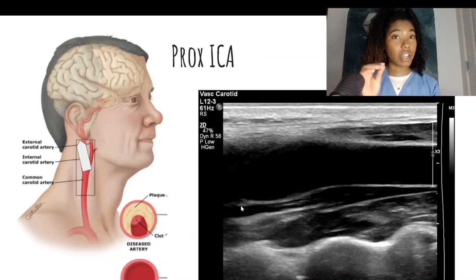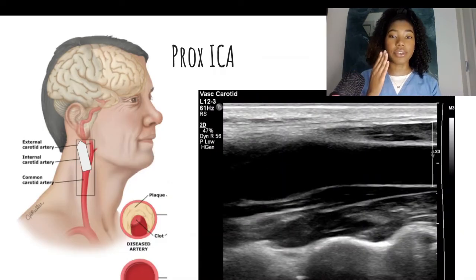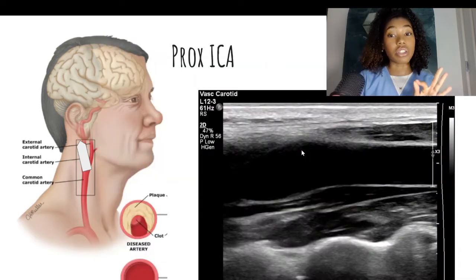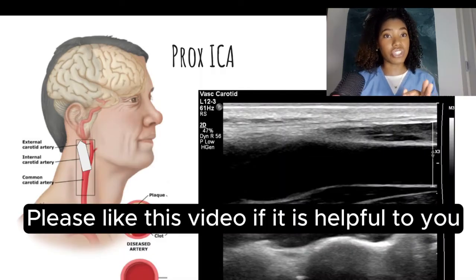Remember, the ICA will be more lateral and the ECA will be more medial. Also, the waveform will be different — I'll get into that. I like to include a little bit of the bulb in my image to demonstrate any plaque. Of course, I don't have any plaque, but if there is some, you want to demonstrate that. That is what the vascular surgeons will be paying attention to.